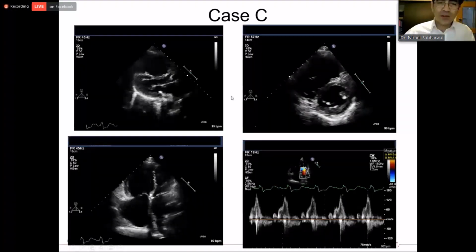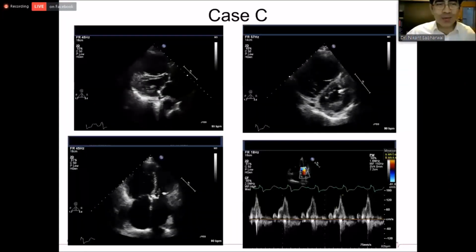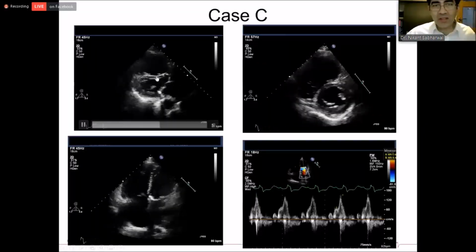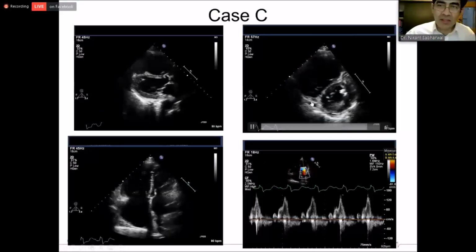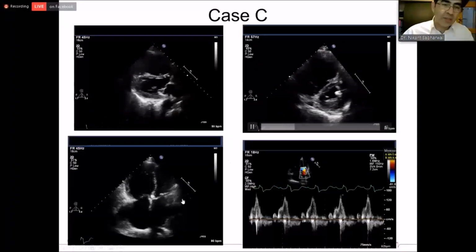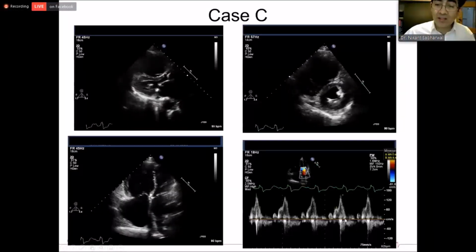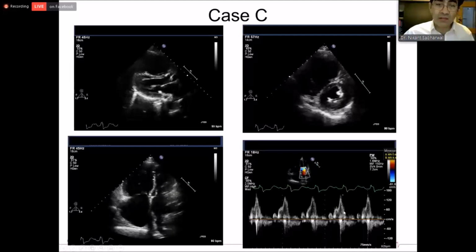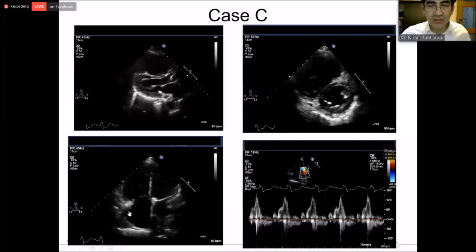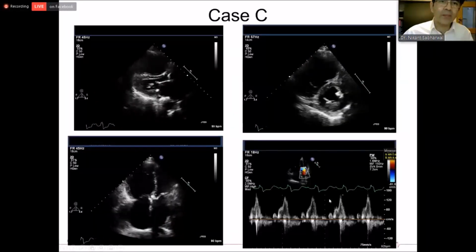This is another patient I look after. She's 89 and she's breathless. You can clearly see it's an abnormal heart. On the parasternal view, big dilated RV, some septal flattening. It's very clear septal flattening on this particular view. So there's clearly going to be eccentricity. Dilated RV we've noted already. Mitral inflow isn't too bad. For an 89-year-old, this is actually pretty good. So just some mild diastolic dysfunction. We can measure tissue Doppler and everything else, but this is still just mild diastolic dysfunction. Her left heart is not the problem in this particular case.